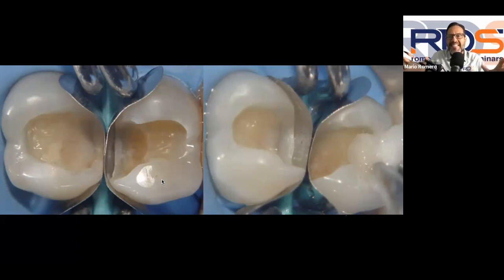And this is something that sometimes with the V-shaped type of rings, like the Ultradent system and other systems out there, you're just not able to accomplish. It's much harder. You have to add resin. You have to add a whole bunch. You have to add Teflon. There are so many tips and tricks for you to make them adapt better that you don't need with this regular, old version, the Bitine Garrison original ring.